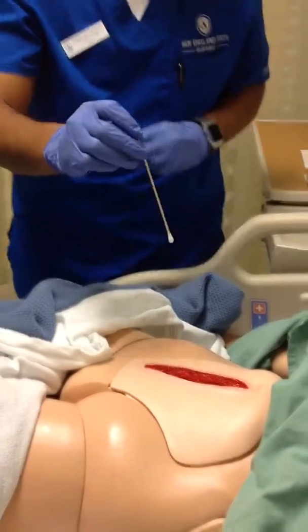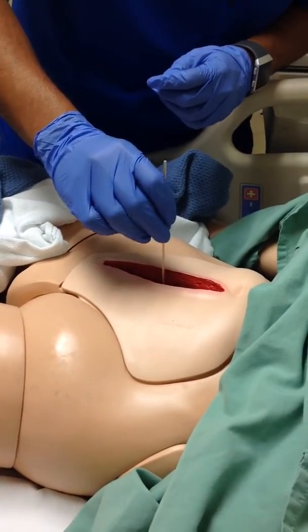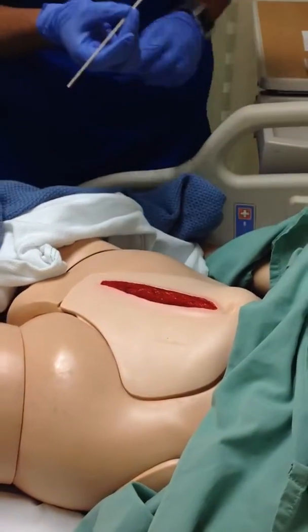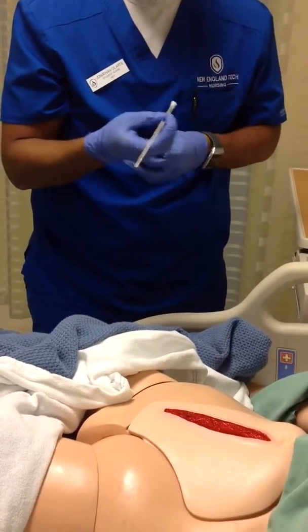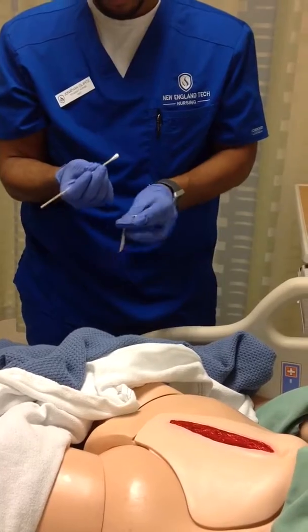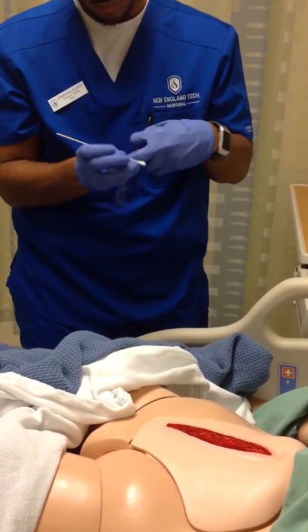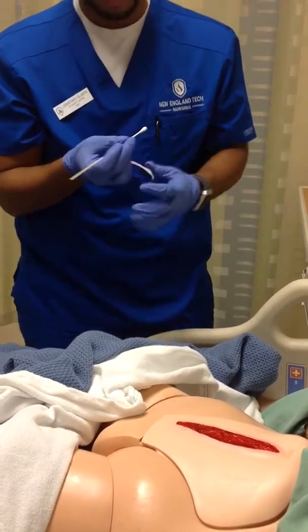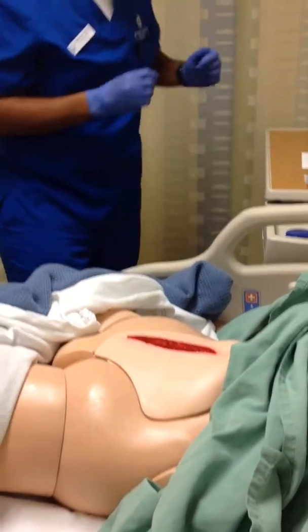Grab one, then I would place it in the patient's wound, trying to find the deepest site. I would bring my fingers down to where the wound would begin, and then I would just measure that. Again, in centimeters, it should be about 3 centimeters. Making sure to document all of that, disposing of this.